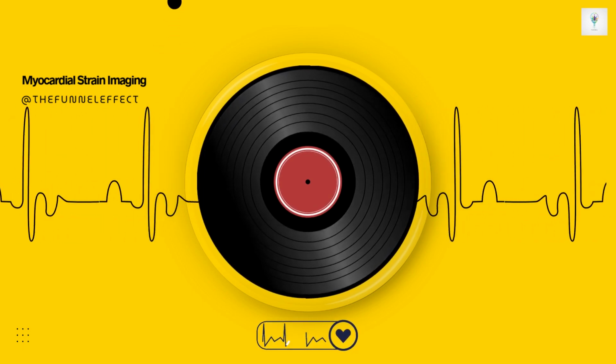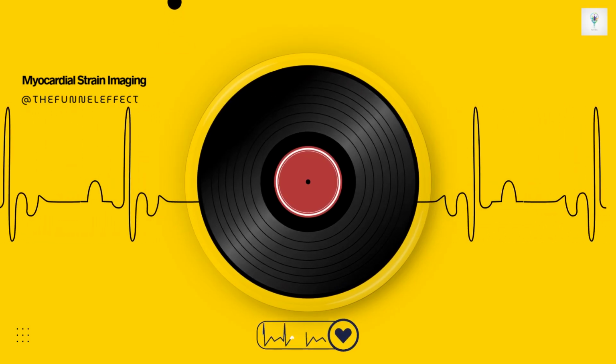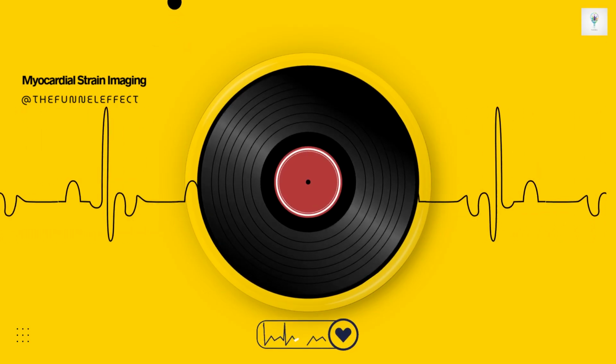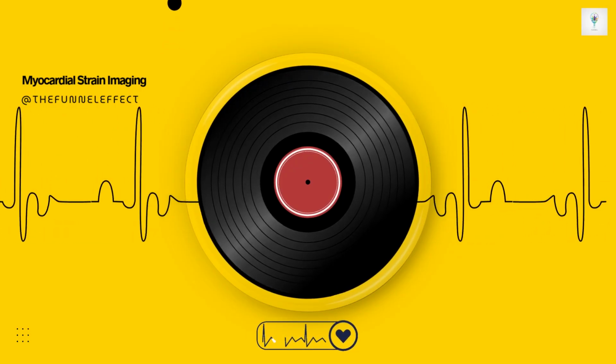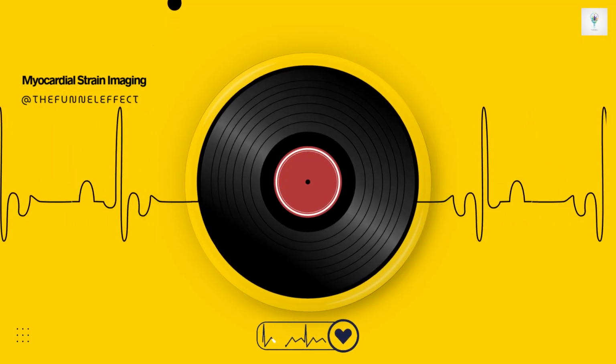Right. Since we know the subendocardium is the most vulnerable layer, it seems logical we'd want to measure its strain separately from the outer layers. Why isn't that standard practice? It's theoretically appealing, but clinically, layer-specific strain analysis for the LV is generally not recommended for routine use right now. There are a few reasons.